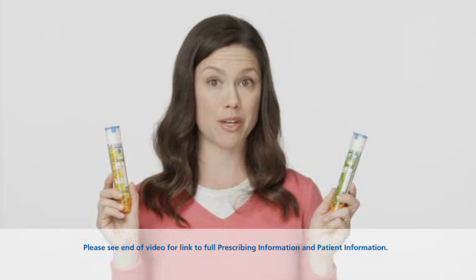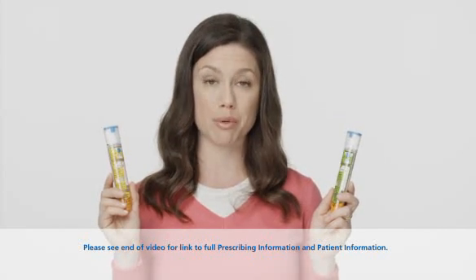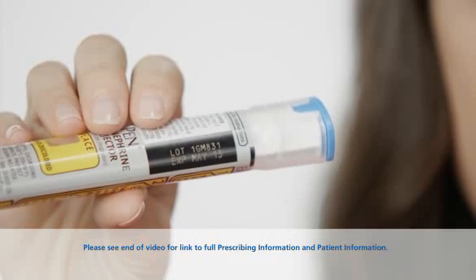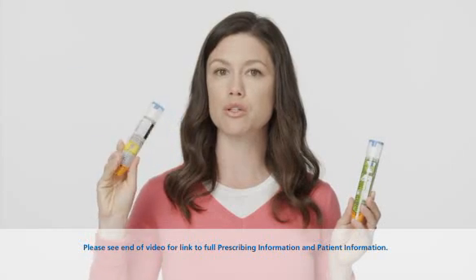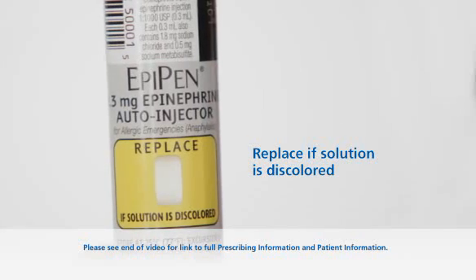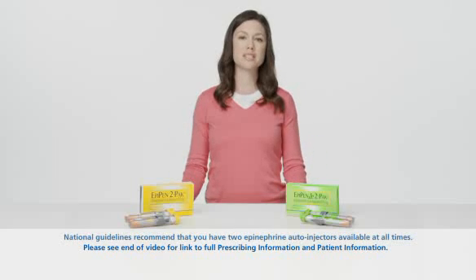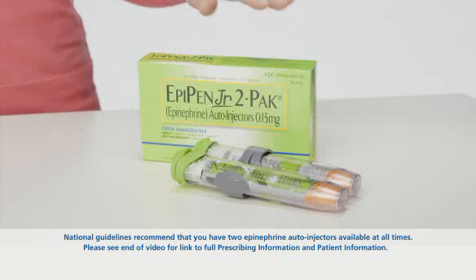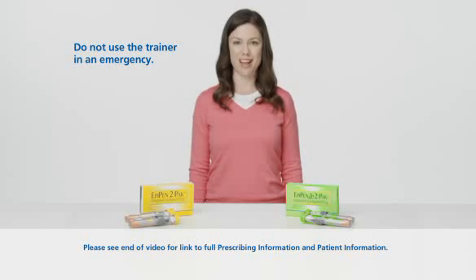Whether you have an EpiPen, EpiPen Junior, or both, it's important to remember to refill your EpiPen prescription before it expires. You can find the expiration date right here on the Auto Injector. Also, take a look to make sure the solution inside the EpiPen is clear and not discolored. EpiPen and EpiPen Junior come in two packs, and each two-pack also comes with a training device.